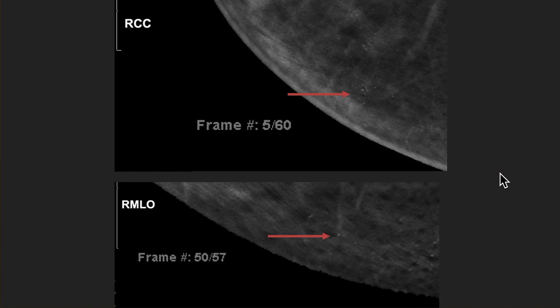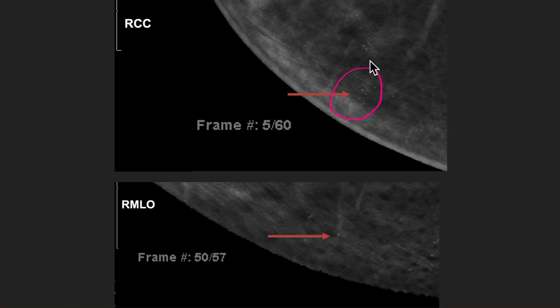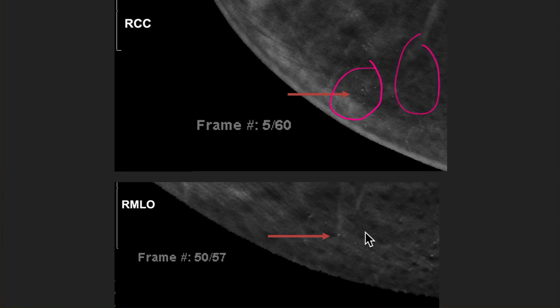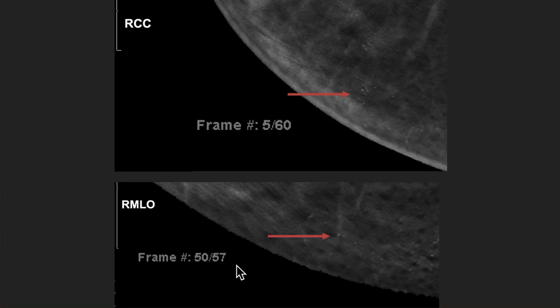Here's just to show you that undershoot and overshoot phenomenon. In this patient, this group of skin calcifications are on frame five, but they are clearly within the skin — you can see other skin-type calcifications here and that chicken skin type appearance. And these calcs here are actually on frame 50 of 57 in the right MLO view.